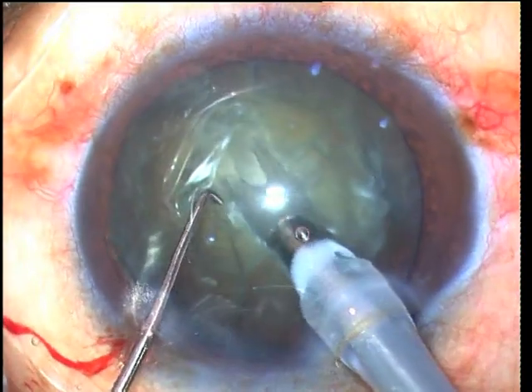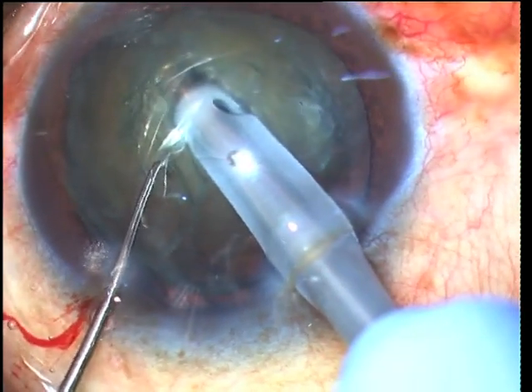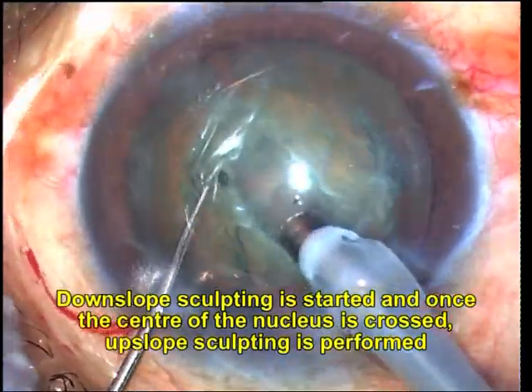Moderate flow, low vacuum, and continuous ultrasound power allows the phaco tip to move smoothly through the nucleus. The power used should be based on the nuclear density, with harder nuclei needing higher power.